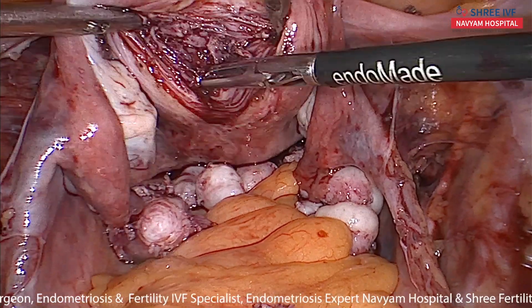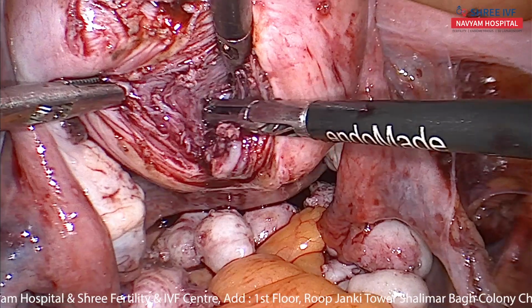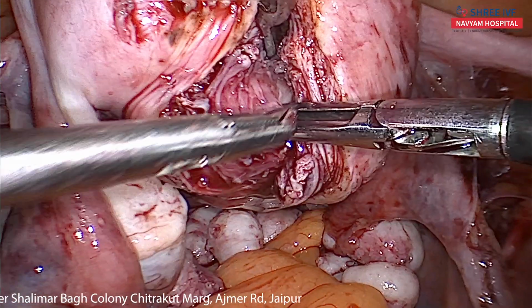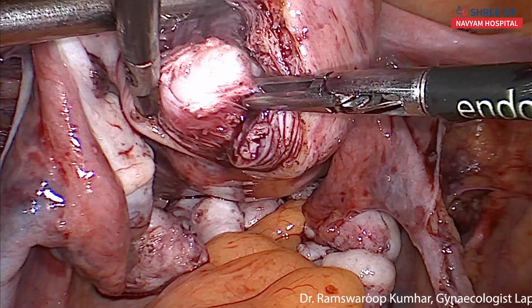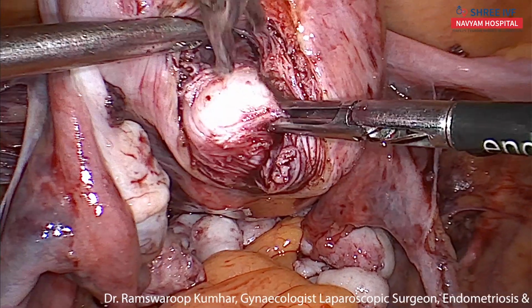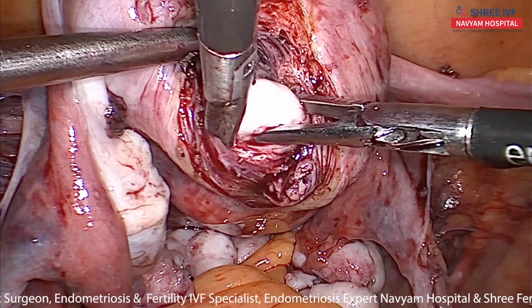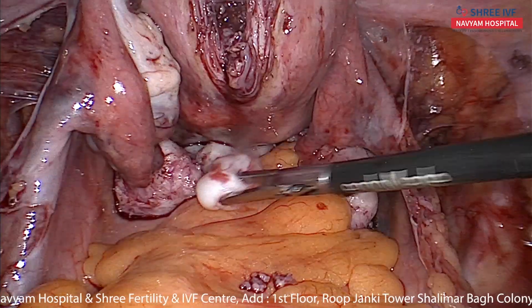Now we have to examine if there is any myoma. Wow, this little one is there.